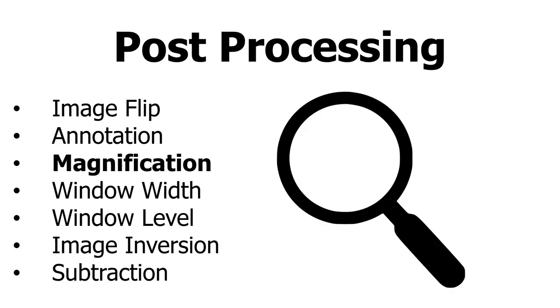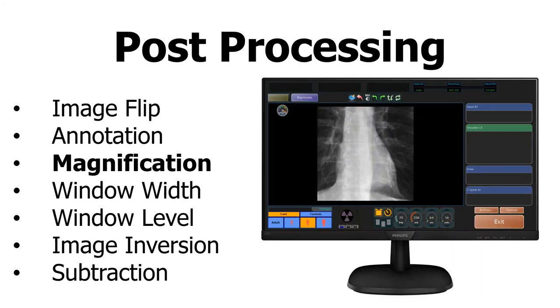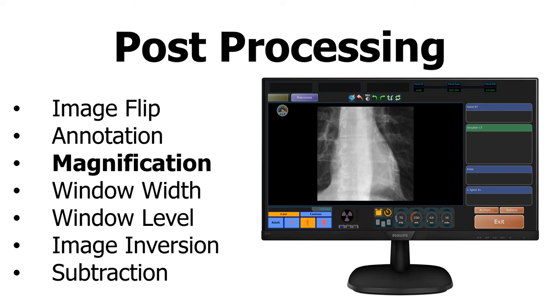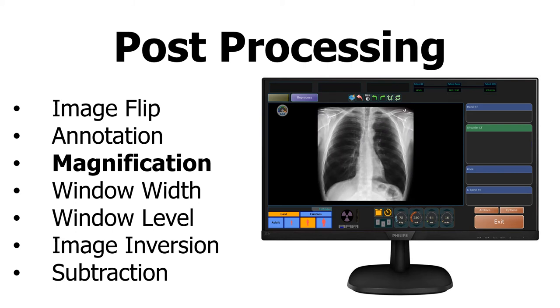Magnification allows you to zoom in to parts of the x-ray image. Many times, you can use the scroll function of your mouse to zoom in and out of images.